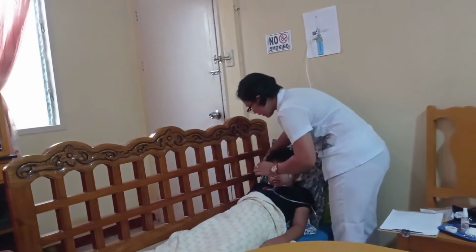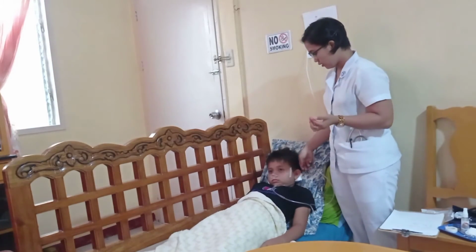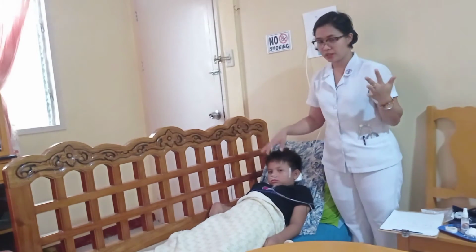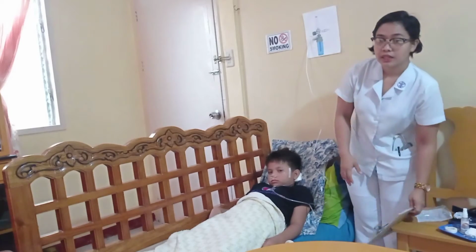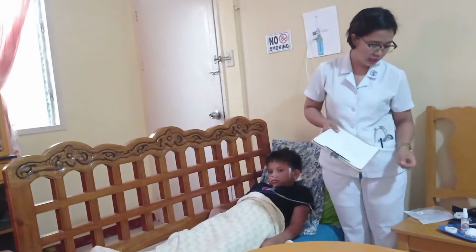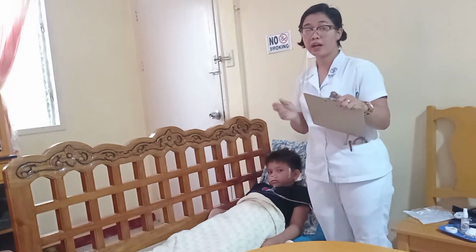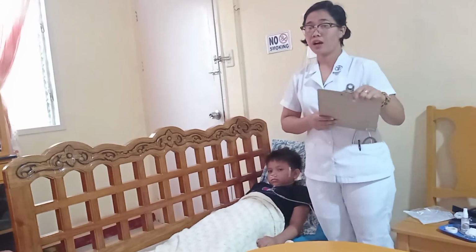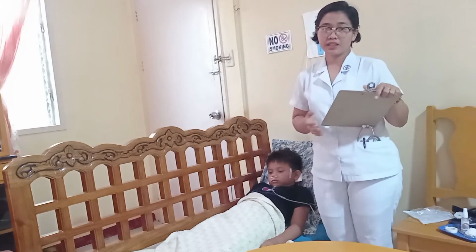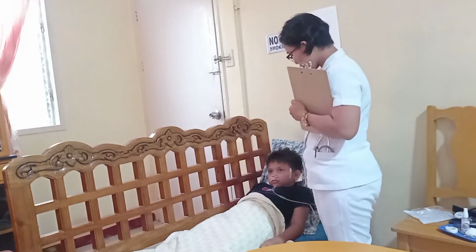I am going to check if there are any ulcerations or any redness, spots, or irritations at the back of the ears, on the nasal part, and the color and ease of respirations of our patient. He already has normal breathing after we put the nasal oxygen therapy on. Regarding the level of anxiety, sir, are you comfortable right now? Not like before, a while ago?